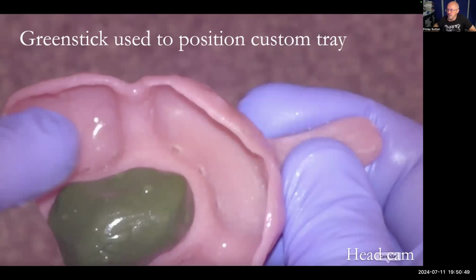Mustafa, do you always use green stick? What is your opinion on pink stick and medium-bodied silicone? So alginate appears to work really well in your hands. Again, this is a great question. I love green stick, but pink stick is really good too. But I prefer in my hands green stick. But if you, Mustafa, like pink stick and it works better for you, use it. That's great.